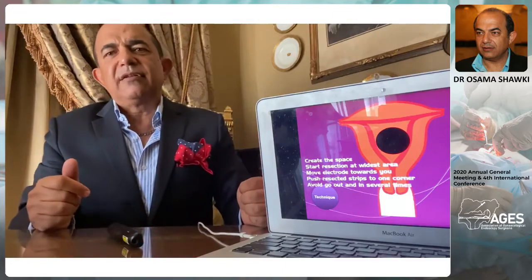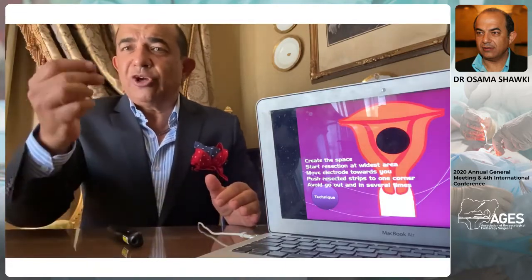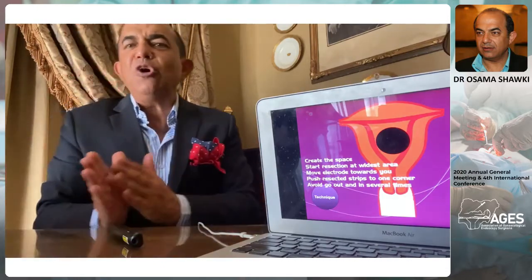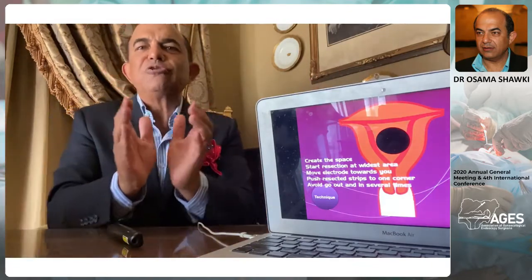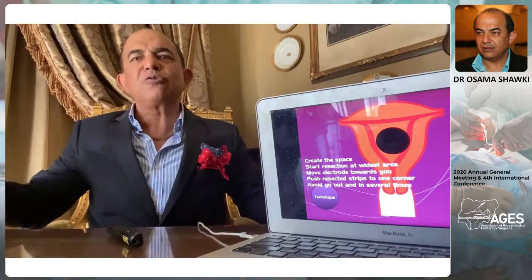Actually, I don't want to show off, but I say the septum in average good hands can be finished in 5 to 8 minutes. So there is no chance for fluid overload. Whatever high pressure it is, the volume of fluid consumed in these 5 to 6 minutes is very low. But if you're not seeing well, you're consuming time.